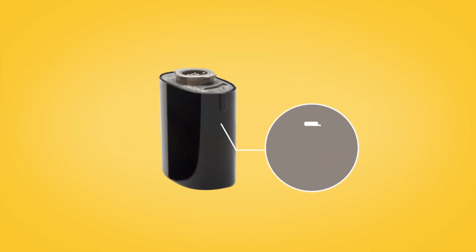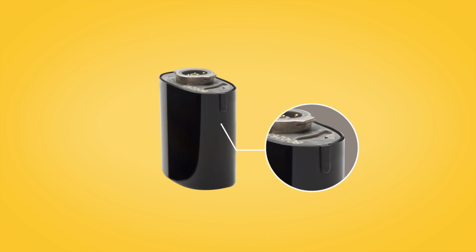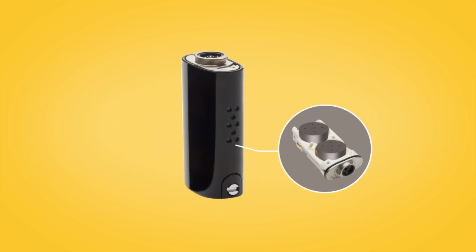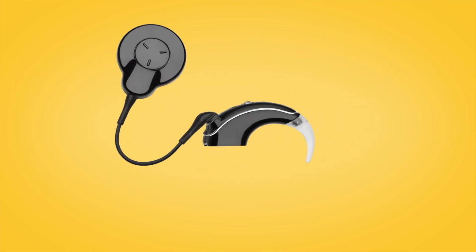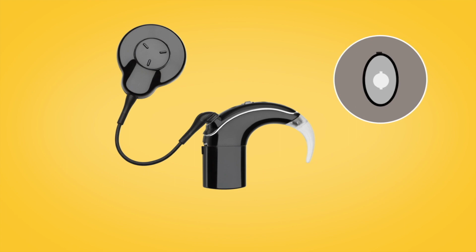If you are using a rechargeable battery module, align the raised marker and arrows towards the back of the processing unit. If you are using a disposable battery module, align the indents and tamper-resistant lock towards the back of the processing unit. Then, to attach the battery module, hold it at a slight angle to the sound processor socket. Once aligned, twist the battery module to attach it to the processing unit.